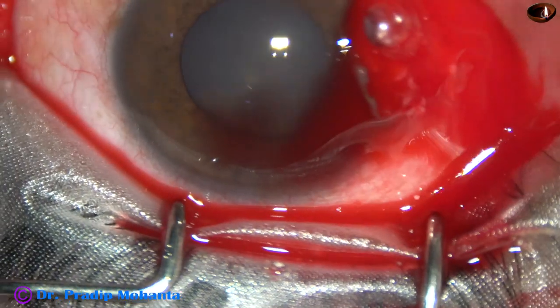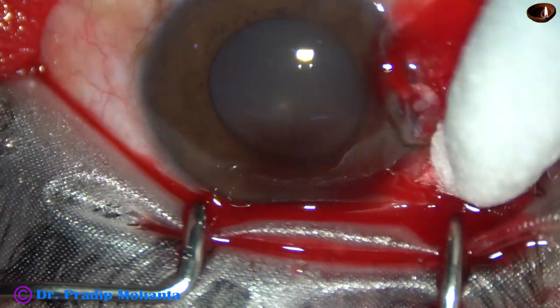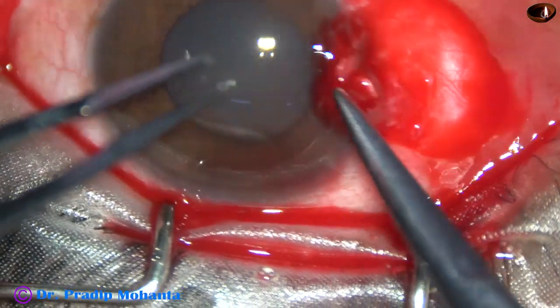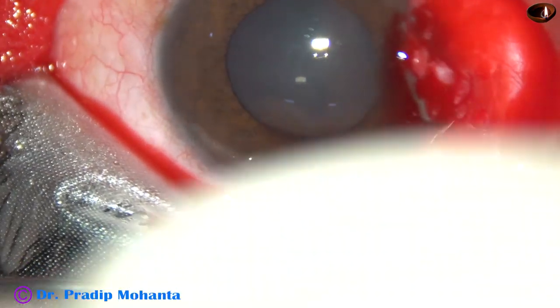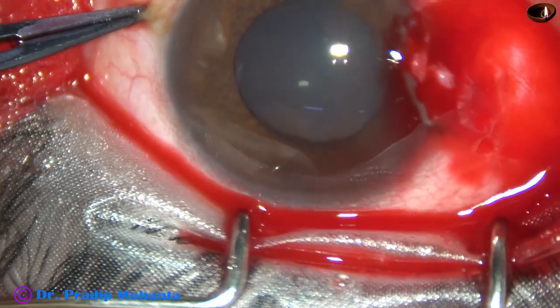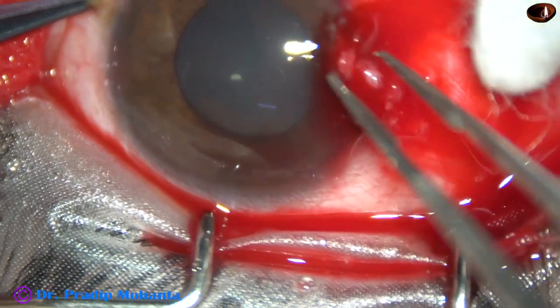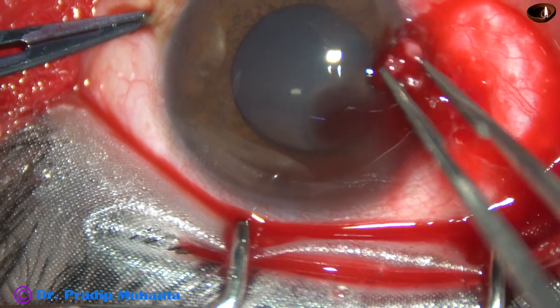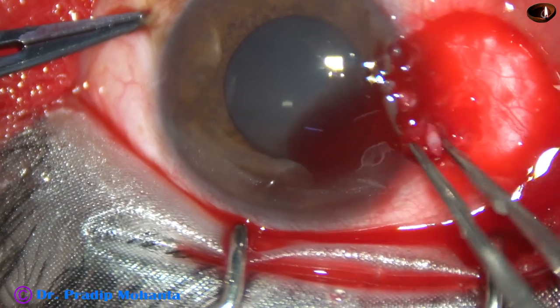This area is to be covered with a graft. Now let us remove the tissue from the cornea. I have taken a crescent blade. Before that, using tooth forceps, I am going to remove the tags.